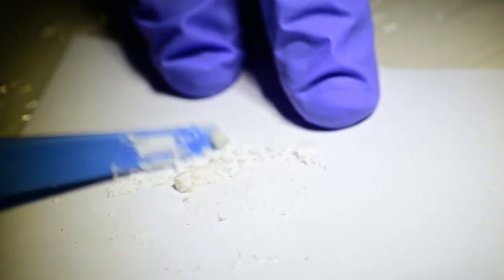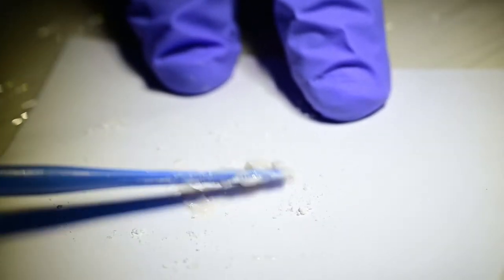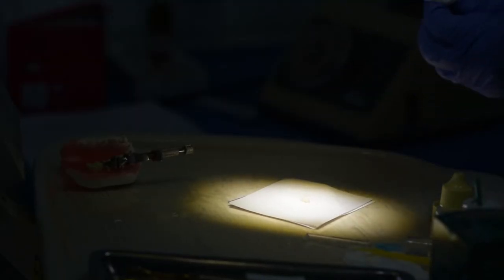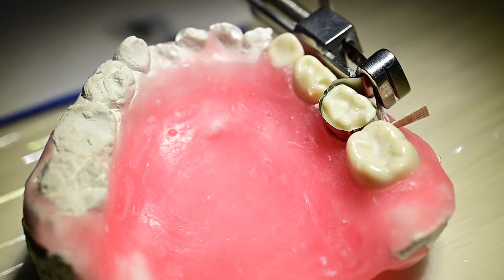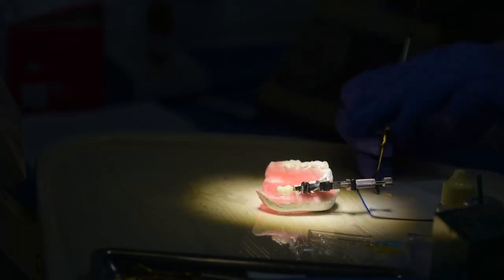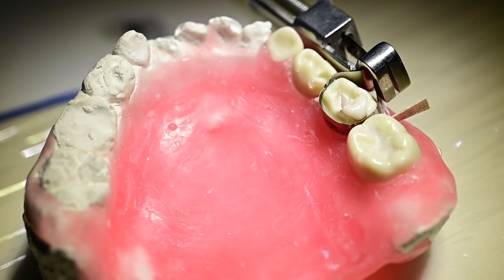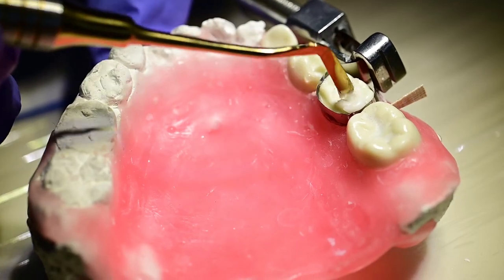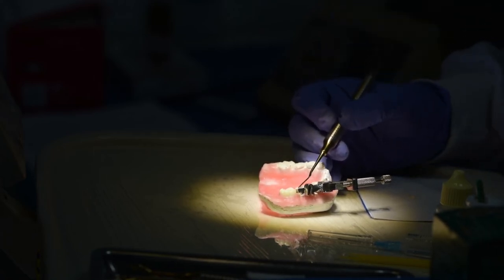So that you have this mix now which is actually restorative and you'll be now able to build up the restoration. A well mixed glass ionomer cement is shiny and should be able to bond well. If it's too dry then now you lose out the chemical bond. I always wipe my instrument so that I don't struggle after that. As you had said when we were manipulating the alkasite, if you want to have an easy release of the material by the instrument, you should actually touch it with a small surface area. And then you should be now ready to build up the restoration. It's actually a packable glass ionomer cement. I should be able to pack it and finish it just like the other restorations. In any case, you know how to do this. So I was not planning to go beyond this in the manipulation of this high strength glass ionomer cement. It is applicable, as we said, in deciduous teeth. And you can use it in low stress bearing areas in the permanent dentition.